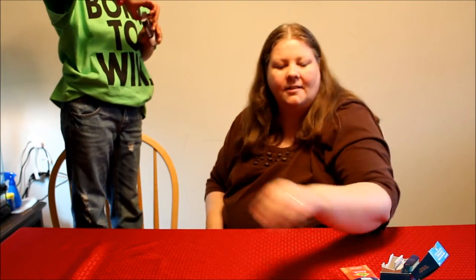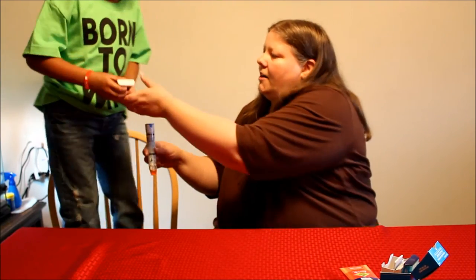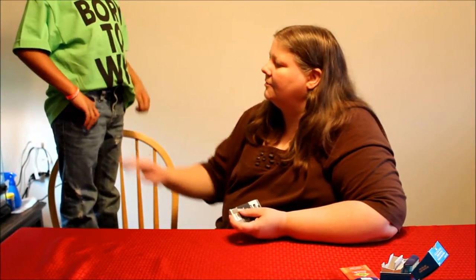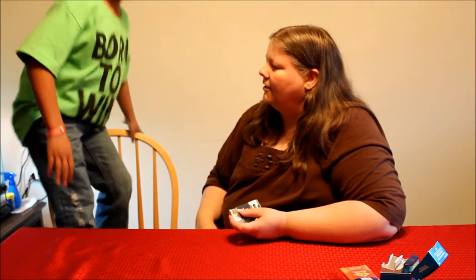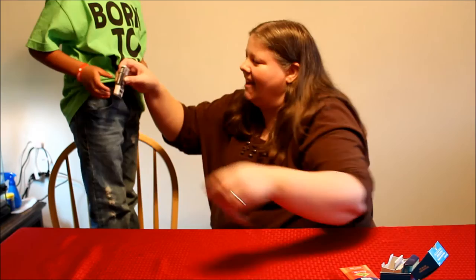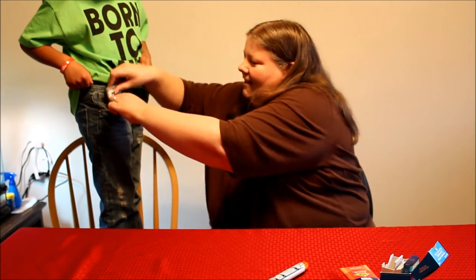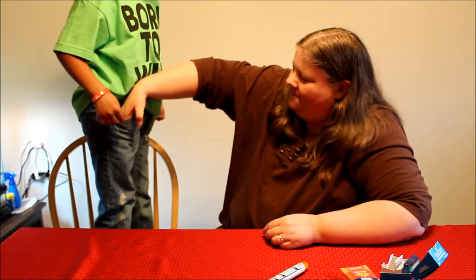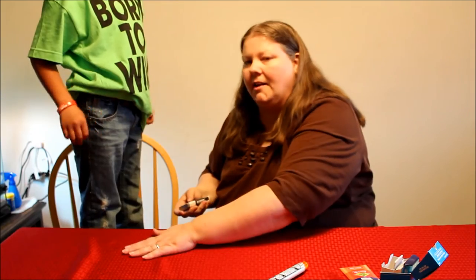Put the trainer in your pocket and see if you can move around. Bend down — tell me if it bothers you. Now try the EpiPen and see if it bothers you. Just a little pressure — yeah, pretty cool, huh?